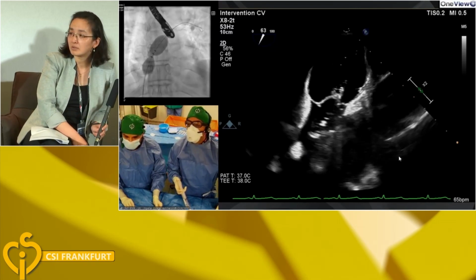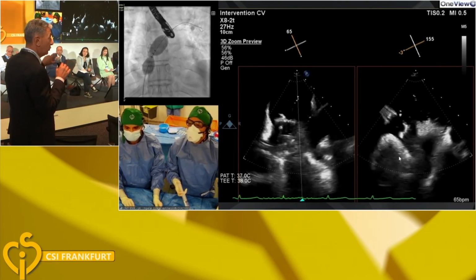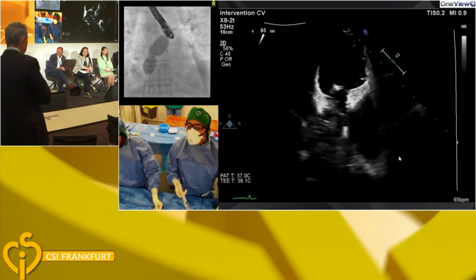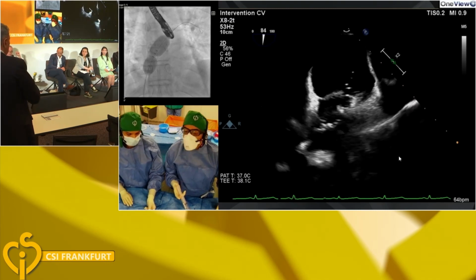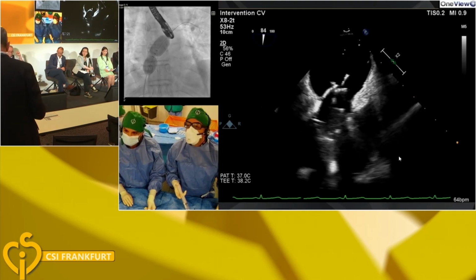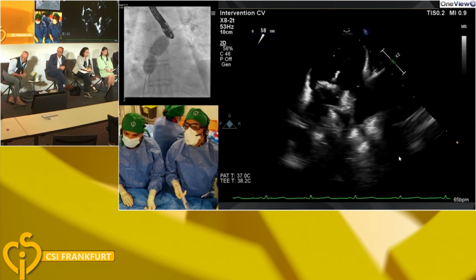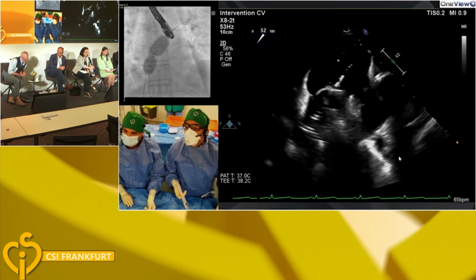I think that the balloon provides information not only for the sizing but also for the pre-shortening and to decide the different devices, because the balloon provides information regarding the sizing but also regarding the anatomy and the change of the anatomy during the inflation. Agree. So I'm definitely a balloon sizer, and I think if you look at that balloon inflation, this rather complicated looking PFO, my guess, is becoming simpler and simpler as we stare at that. And I think that's where balloon sizing really helps.